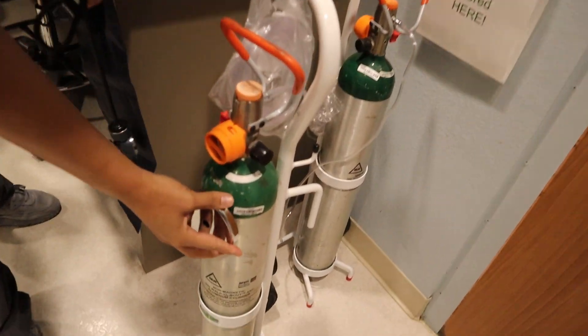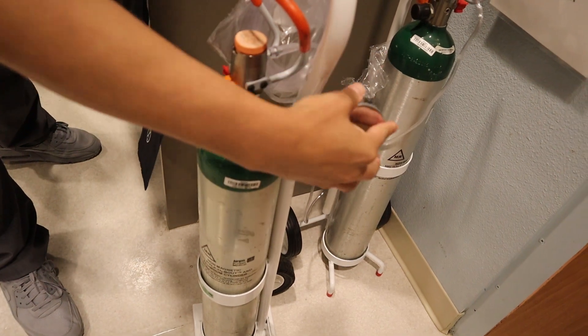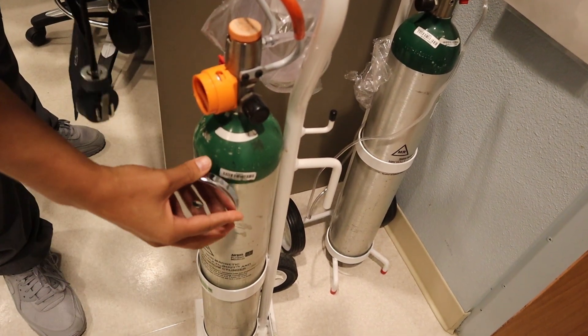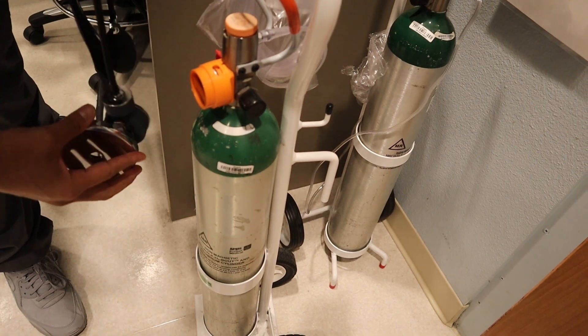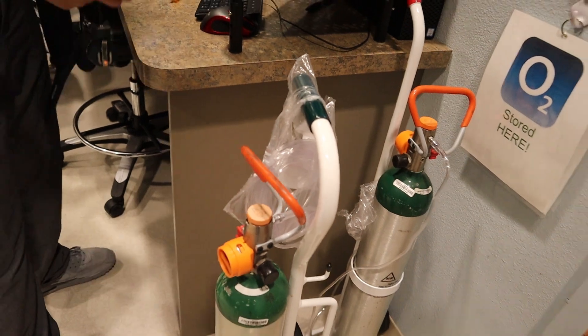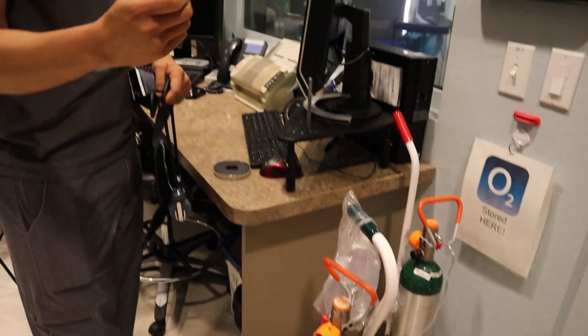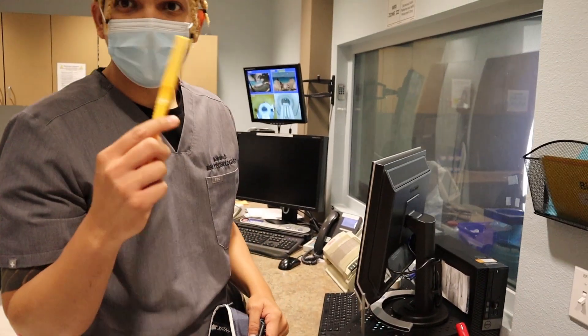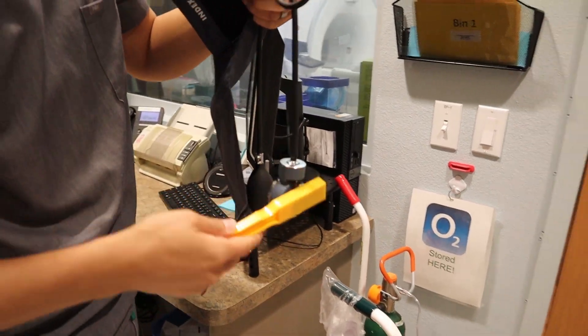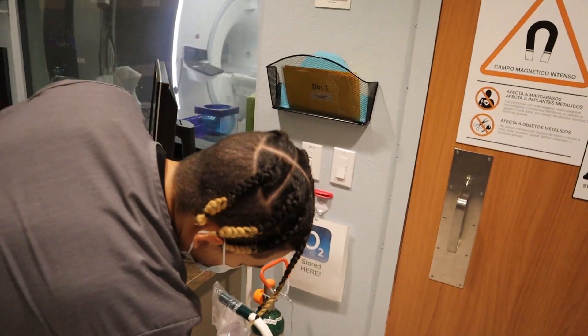Now look at the MR-safe tank — see the difference? Good to have this MR-safe equipment. We have different ones, like this one too. Sometimes we check earrings and nose piercings, whatever. See that? Got the little checker — good to go.